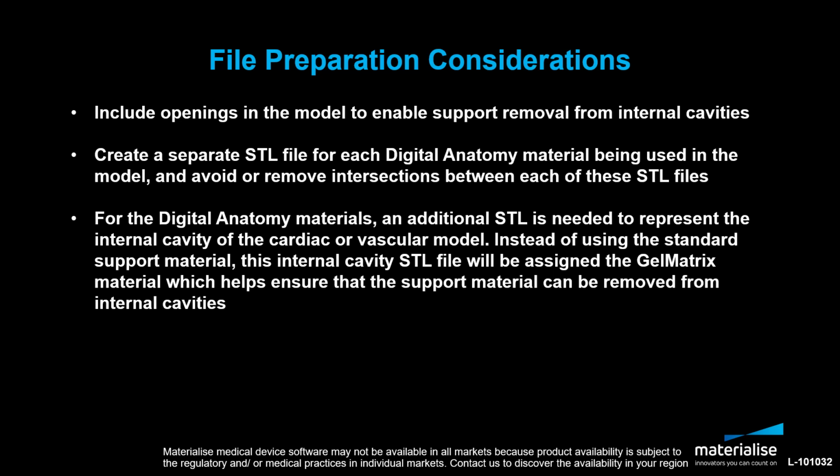First, be sure to include openings in the model to enable support removal from internal cavities. Next, create a separate STL file for each digital anatomy material being used in the model and avoid or remove intersections between each of these STL files. Finally, for the digital anatomy materials, an additional STL file is needed to represent the internal cavity of the cardiac or vascular model. Instead of using the standard support material, this internal cavity STL file will be assigned the GelMatrix material, which helps ensure that the support material can be removed from internal cavities.